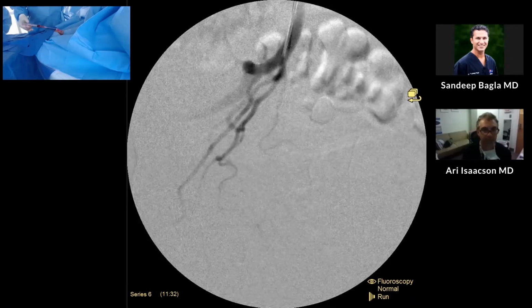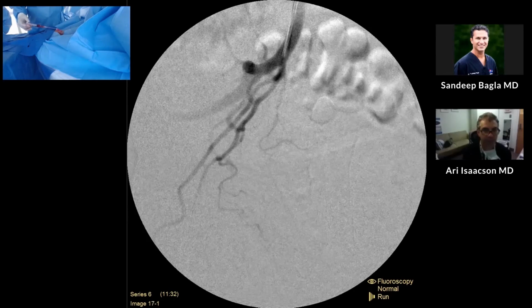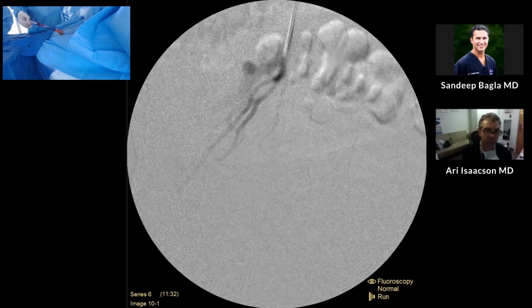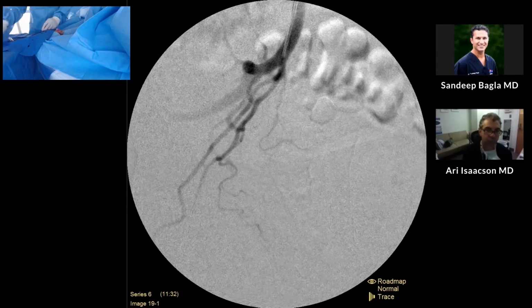Yeah, it's a good question. I will say that, for me, once I see the absence of that early parenchymal staining, then I'll go to the 250s. I really want to get rid of that staining, get really good distal embolization with the smaller beads. I think one of the challenges with using too big of a particle size is that we end up with early embolization. And I think that early endpoint is really what I'm trying to avoid.